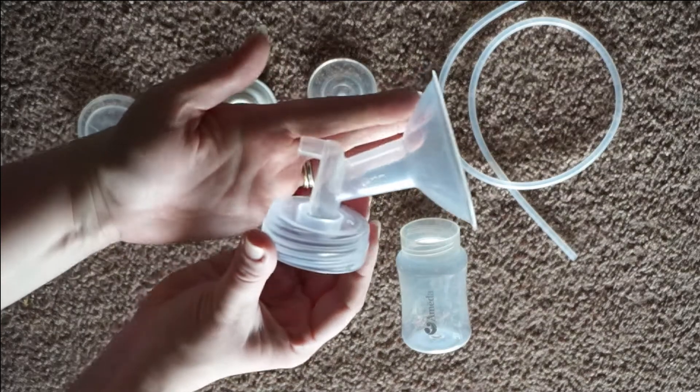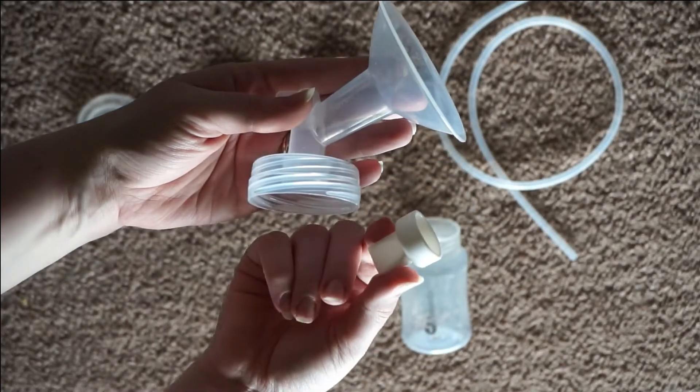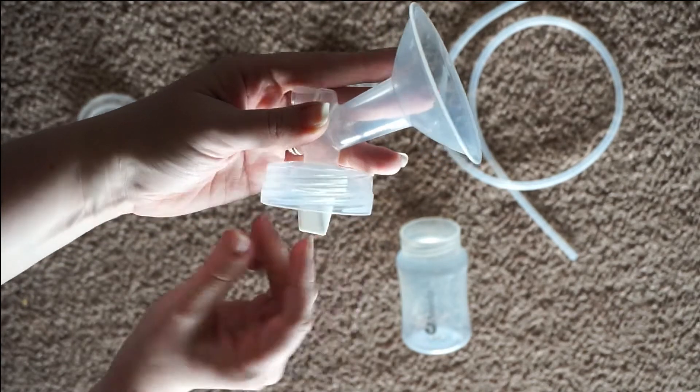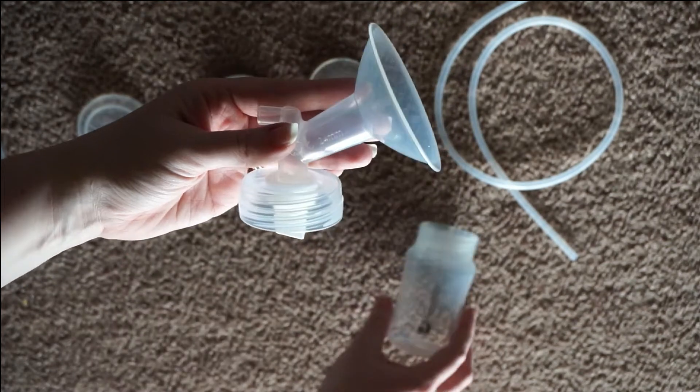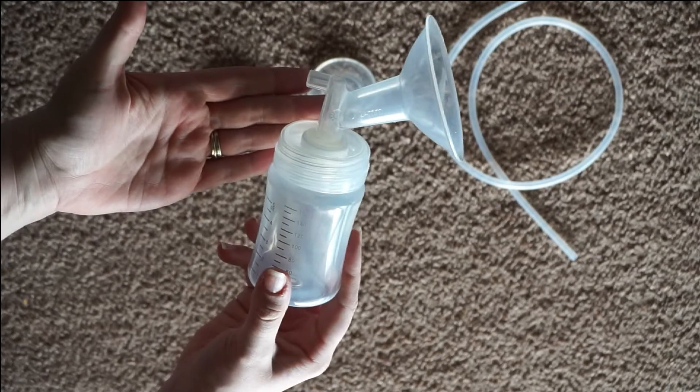This is kind of like an all-in-one piece — it's your flange and your connector. There's not a whole lot else to do other than take your white membrane and just press it up on there. Try to be delicate; these things can rip sometimes. And then you just go ahead and screw your bottle on. That part's really simple.